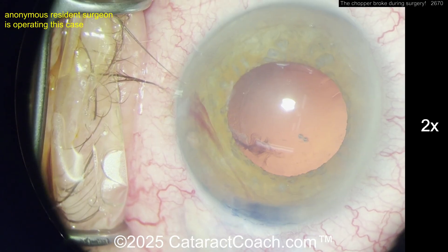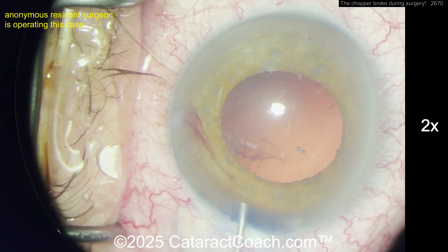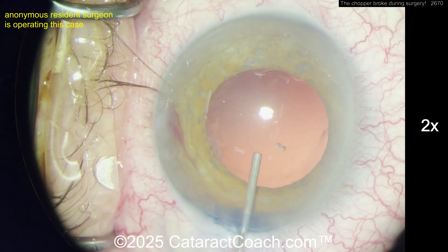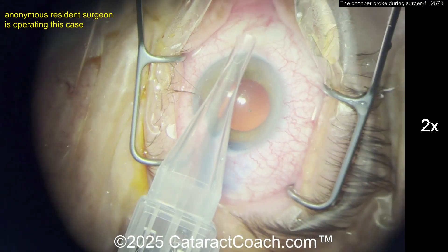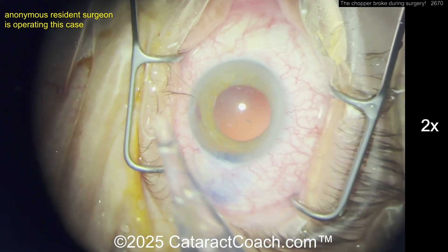Examine the chopper and make sure the pieces fit back together — make sure there's not a third little piece fractured somewhere else in the eye. That's a super important step. This is why in my instrument trays I don't use steel instruments anymore. All my instruments are titanium, which is stronger than steel.